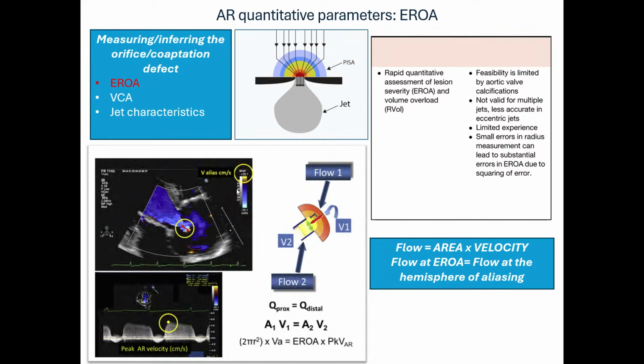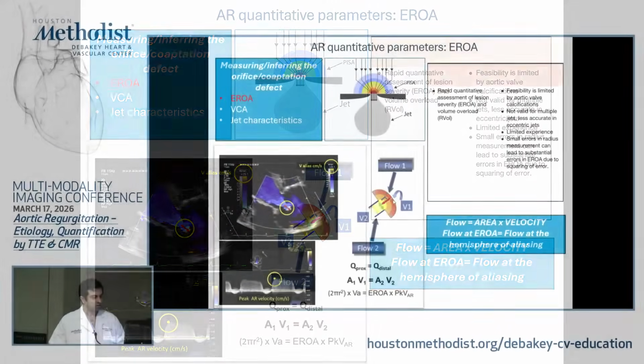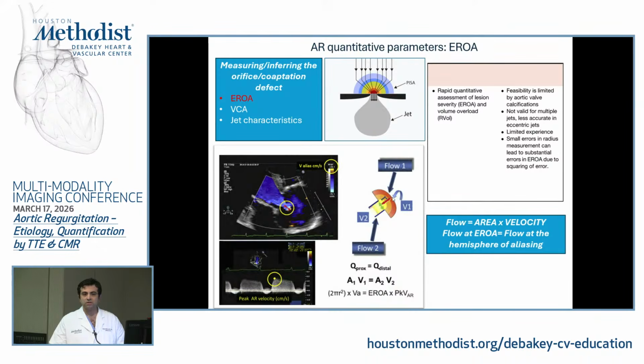So who can tell me what aliasing is, first of all, because we don't review this very often. So what does it mean for me to shift the baseline and demonstrate aliasing between two sides of the surface between the hemisphere and the circle versus away from it? What is all of this even?